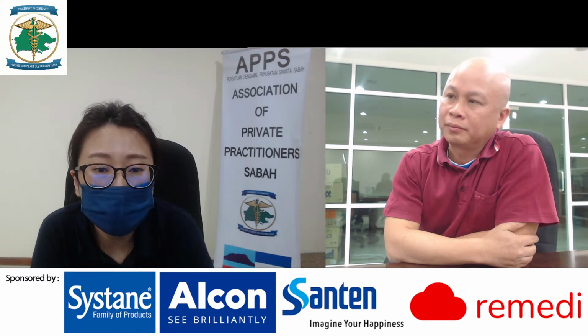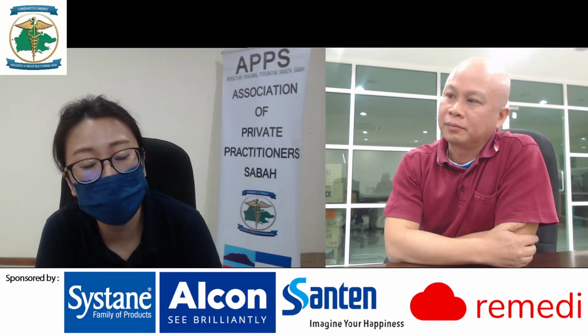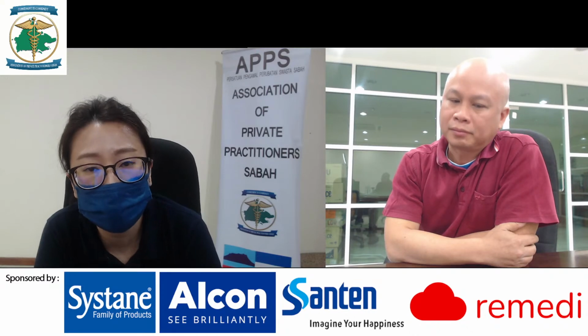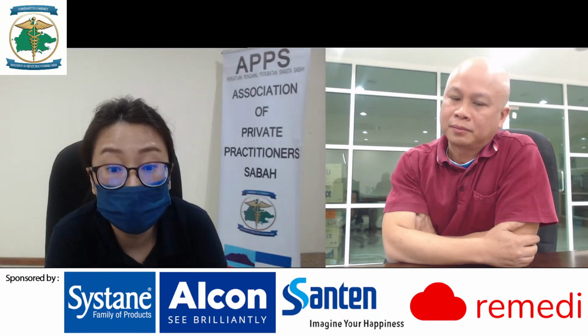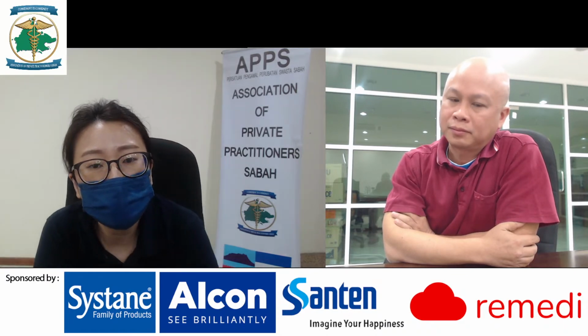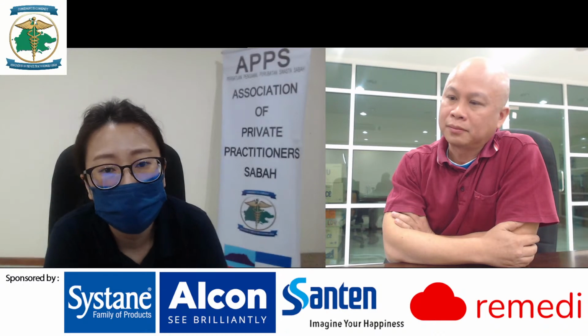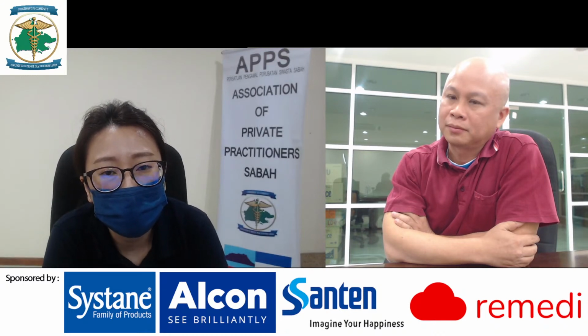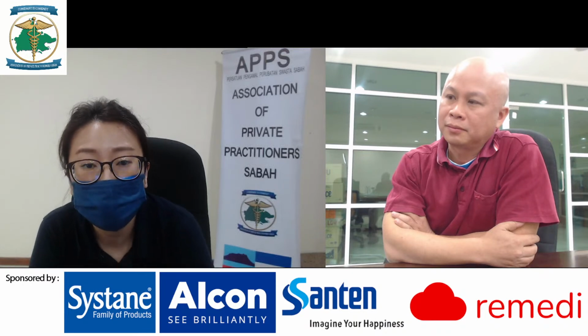But at the moment, we have a presbyopic ICL, which is available to correct ametropia and also presbyopia. And fourthly would be a refractive lens exchange, but that is only suitable for those people who have mild lenticular changes, such as a mild cataract and beyond.